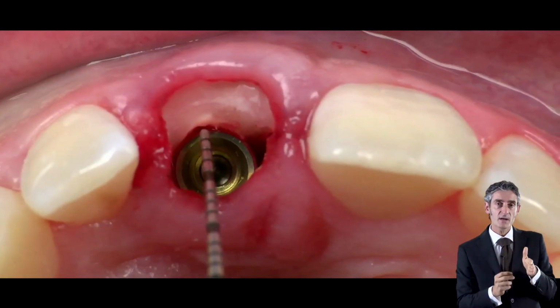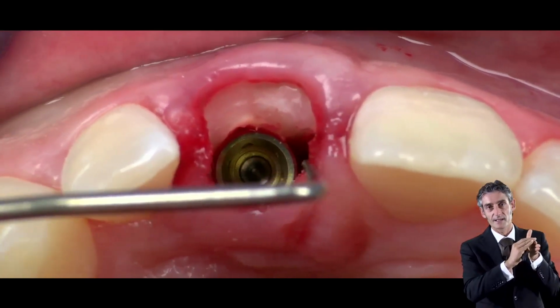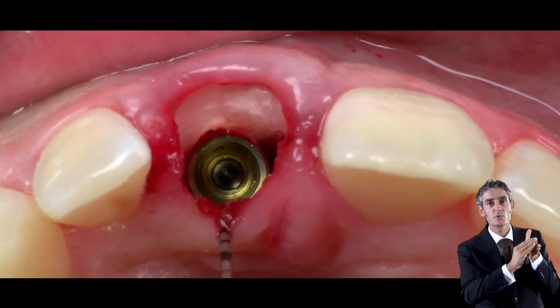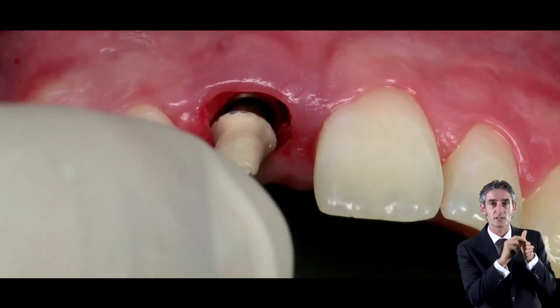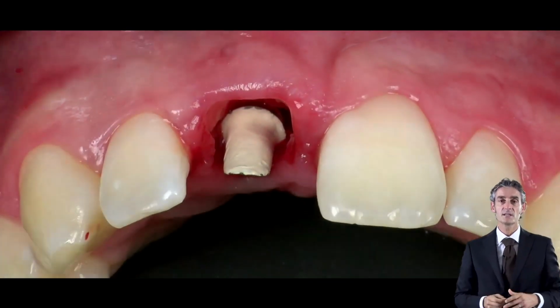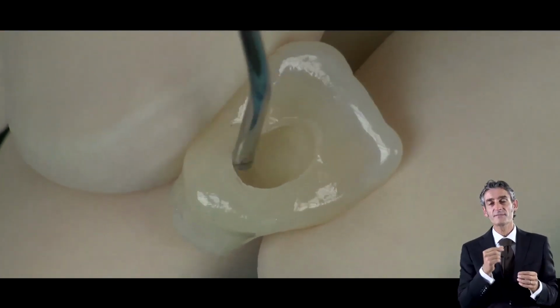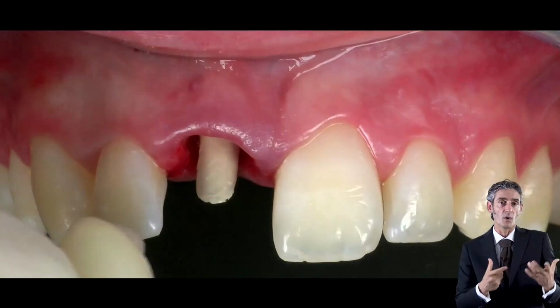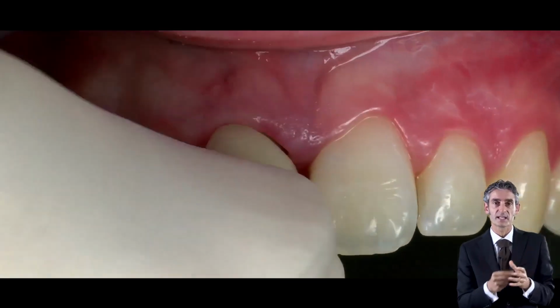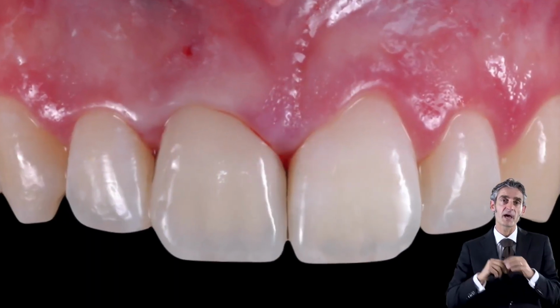Another aspect that is really important: the inner part of the sharp angle must be smoothed completely, in the way to avoid any contact between the future provisional abutment and the shield. As you can see here, I also created a provisional restoration that normally I fix in the mouth with flowable composite, exactly in the position that I want. After the flowable composite sets, it's removed from the mouth and refined outside.